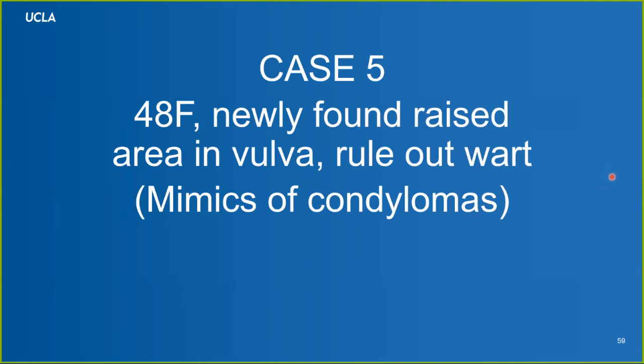So this is a 48-year-old woman with a newly found raised area in the vulva, rule out wart. Because the clinicians are very used to the diagnosis of wart, a lot of the polypoid appearing lesions come with that differential. But under the slide, they may end up being a very diverse group of diseases that mimic warts.